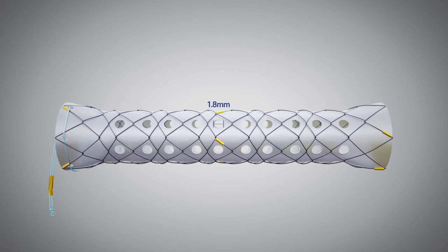There are multiple holes with the size of 1.8 mm in diameter. The flare ends can reduce the migration risk.